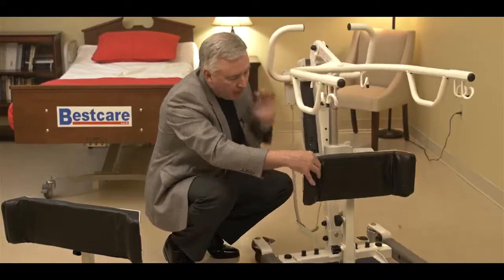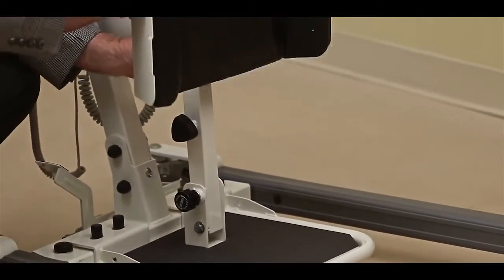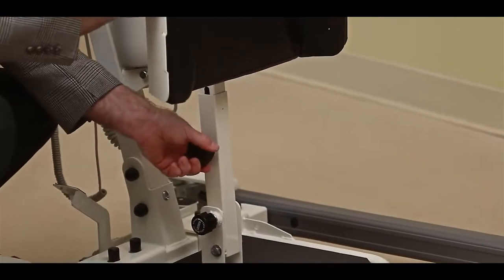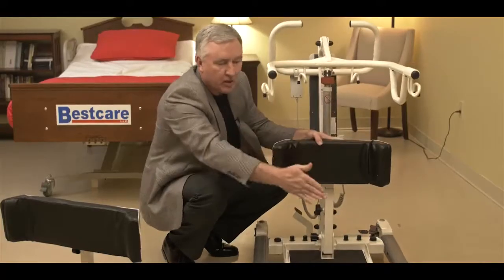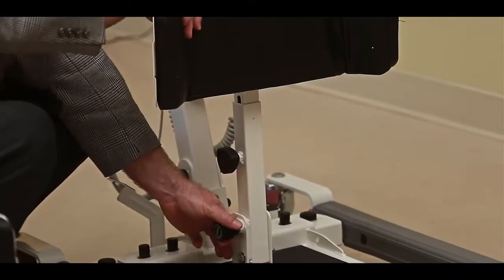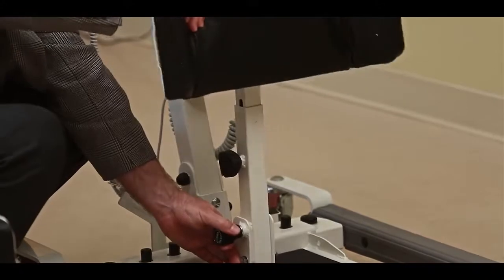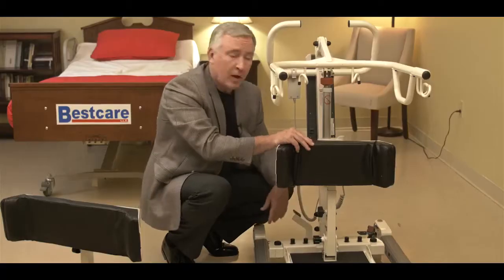We can raise and lower the knee brace with a knob on the side — just loosen it, raise it to a comfortable height, and tighten it again. We can also adjust the position of the knee brace with the knob at the bottom. When we pull it out, we can tilt the knee brace forward, or put it back to make it comfortable for the transfer.